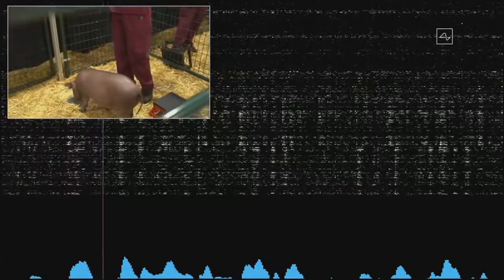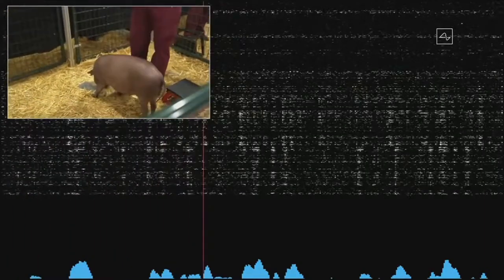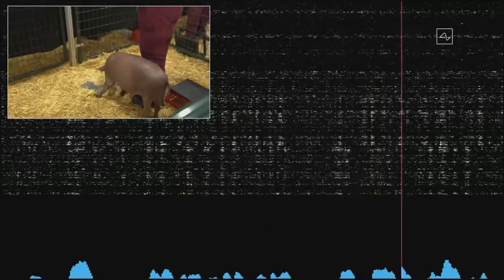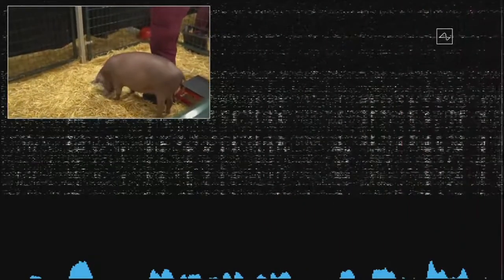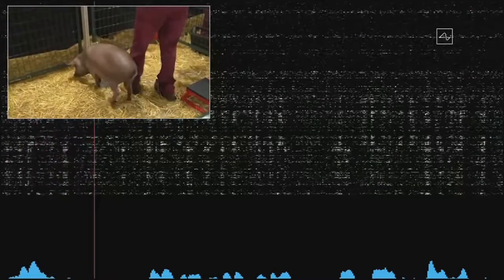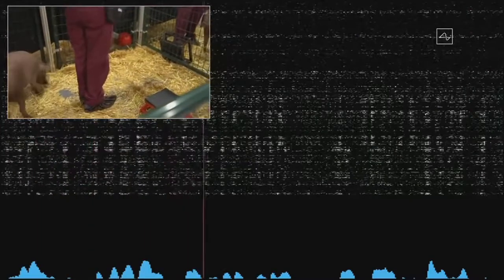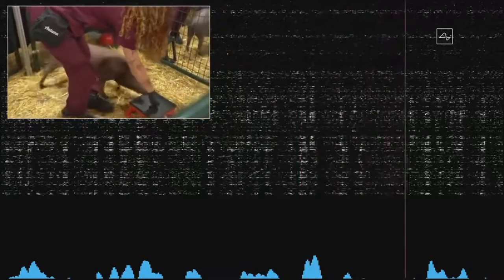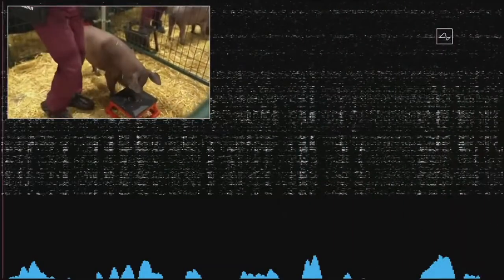So the beeps you're hearing are real-time signals from the Neuralink in Gautry's head. This Neuralink connects to neurons that are in her snout. So whenever she snuffles around and touches something with her snout, that sends out neural spikes, which are detected here.